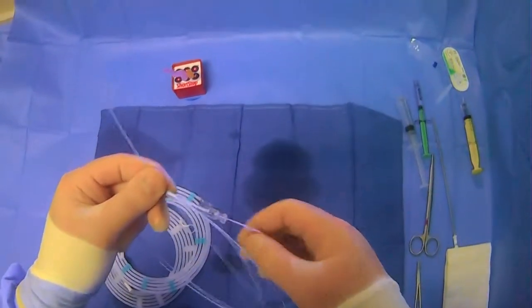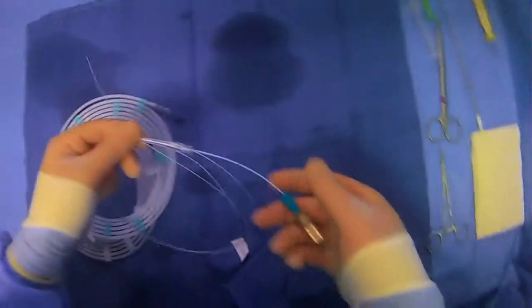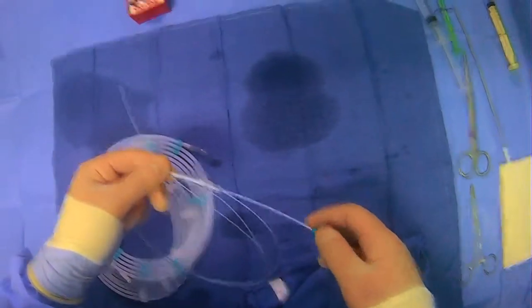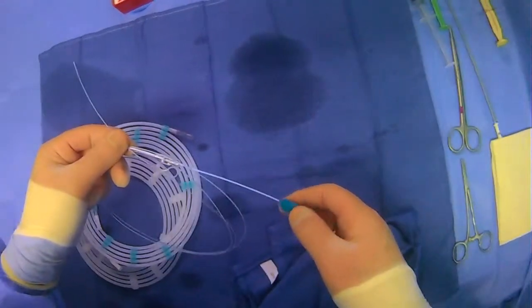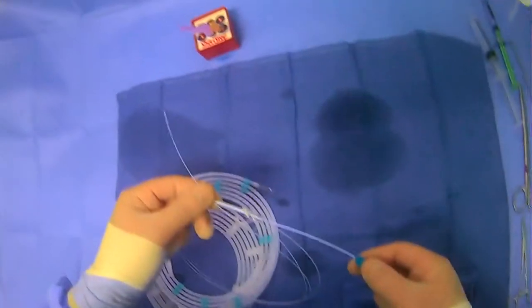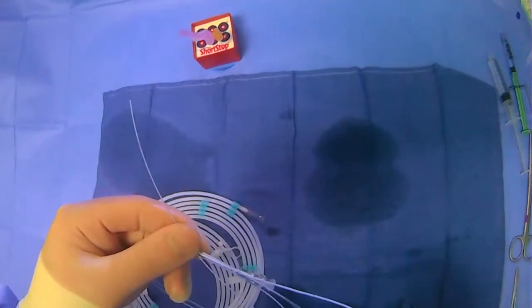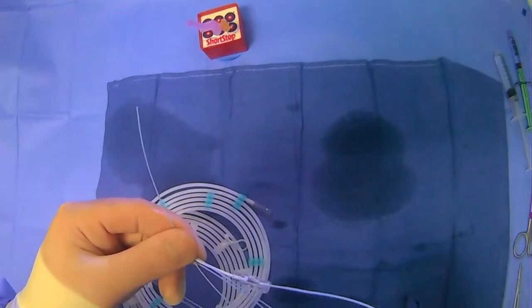All right, and now, we won't ever be really using it like this, but just to show you what movements you'll do, you'll pull, you'll keep this cheater in place and you'll pull the back end here to pull the loop into the microcatheter and then you'll push it in.